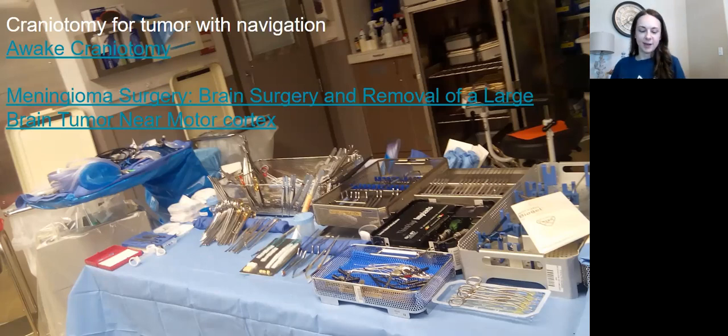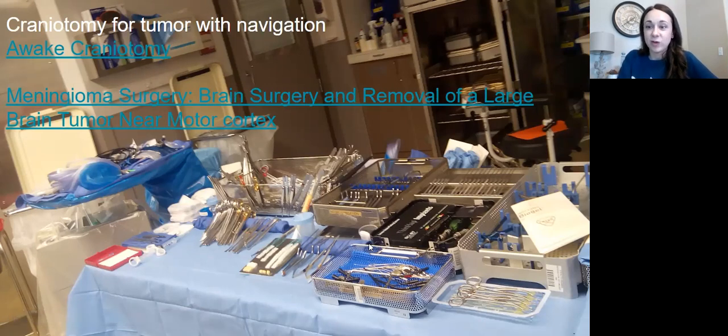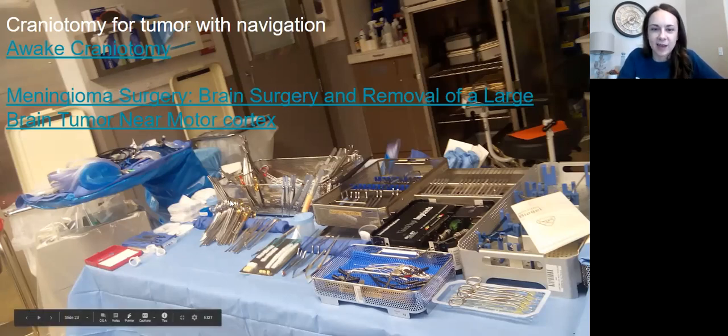And as I keep reading, I think I hit everything else, so I will go to the closing. So you guys already saw this plating system, and I talked to you about plating that bone flap. The only thing I would say is if you do plate that bone flap yourself, make sure you are writing down your plate and screw numbers and exactly how many you used. Okay, well, let's look at this table for a second before I stop with craniotomy.